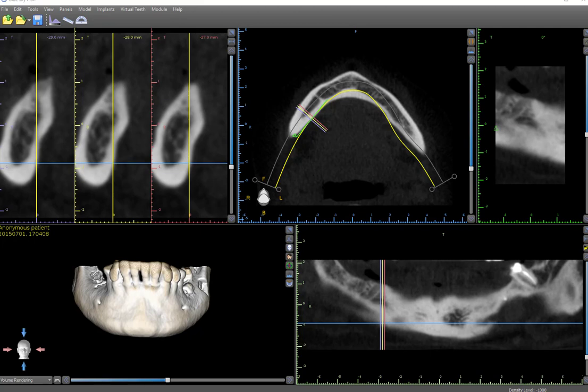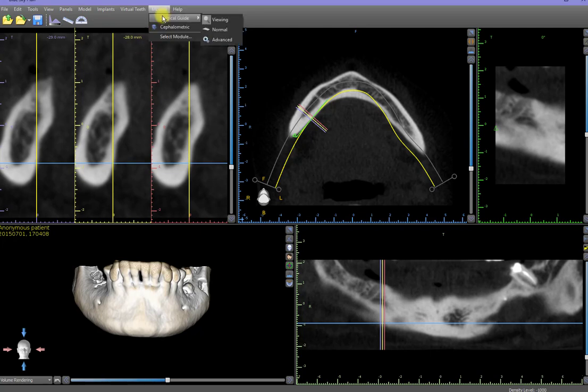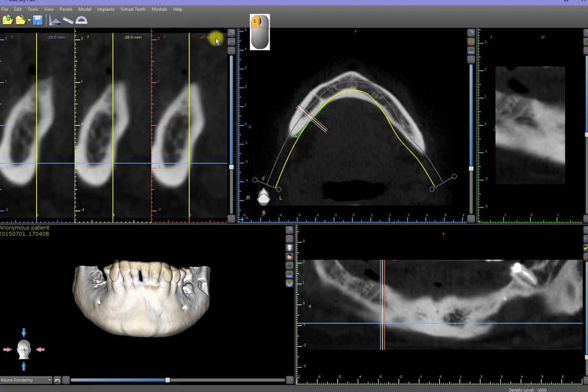Viewing mode lets the user manipulate the images only, as all editing toolbars and functions are hidden. Depending on the version of Blue Sky Plan that you're using, left click on the Mode or Module menu. Mouse over Surgical Guide and see if Viewing, Normal, or Advanced is highlighted. If Viewing is highlighted, click on Normal or Advanced.